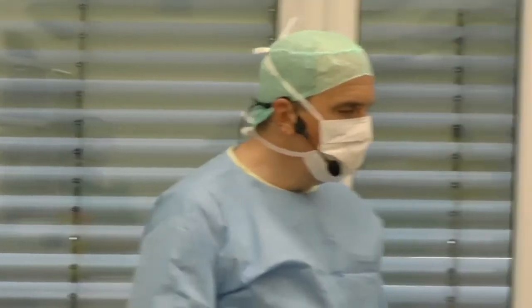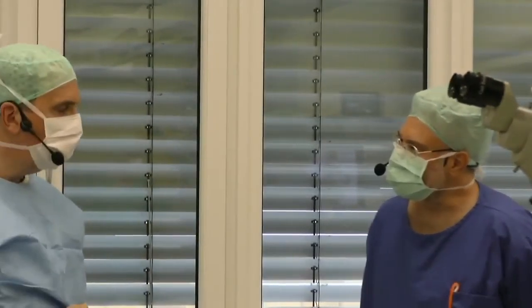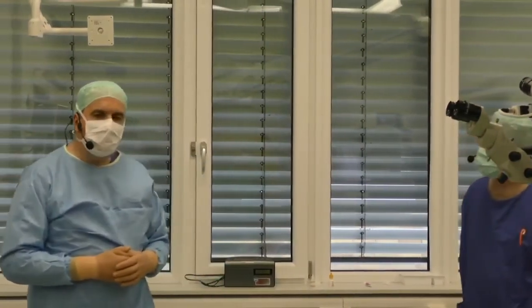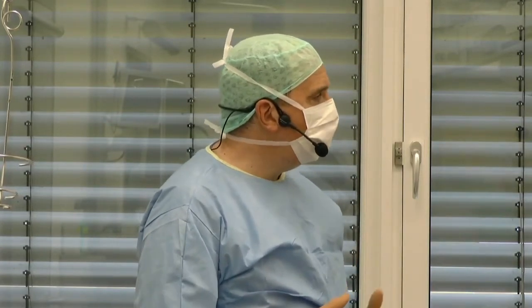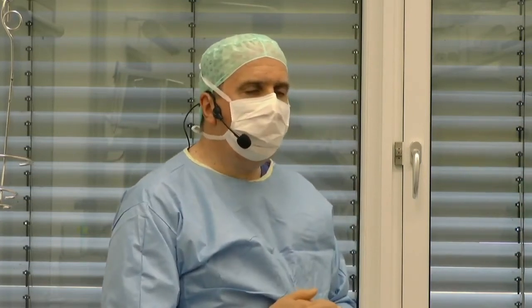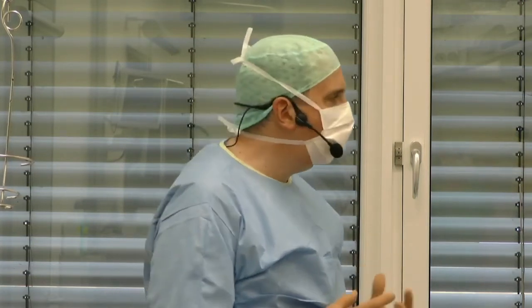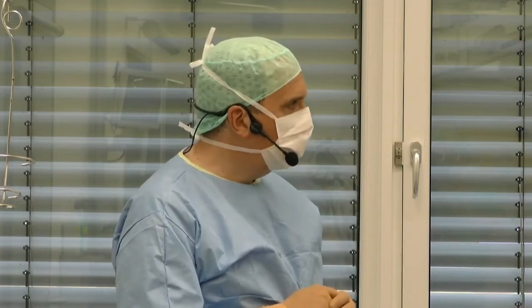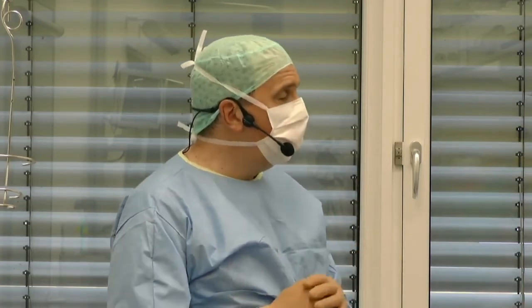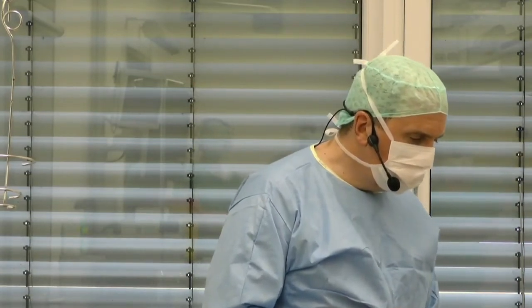So from a very simple viewpoint, I would think using two lenses would create worse vision than that obtainable by a trifocal lens. Yeah, I always have with regard to the question if there's a problem of getting two inside the eye, if a camera company wants to improve the optic quality of a camera system, they put lenses in and don't get lenses out. So we have the experience that with two lenses you have less dysphotopsia and less optical side effects, let's say, than with one IOL. Even if we compare the array from the same company, we end up with better results with the two-lens system. Do the use of two lenses complicate your calculations?